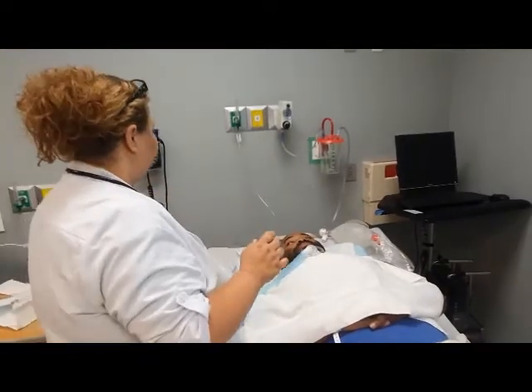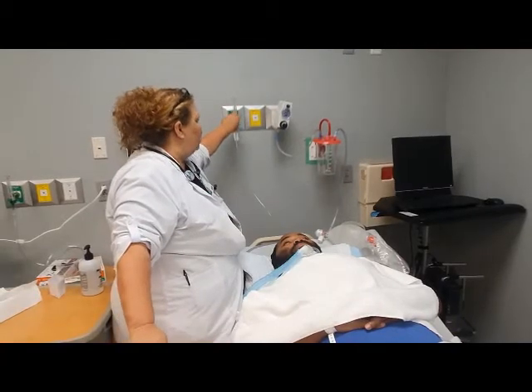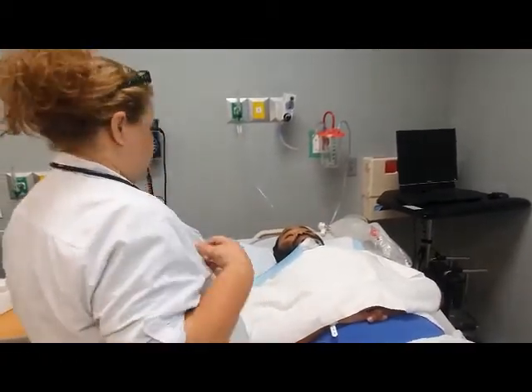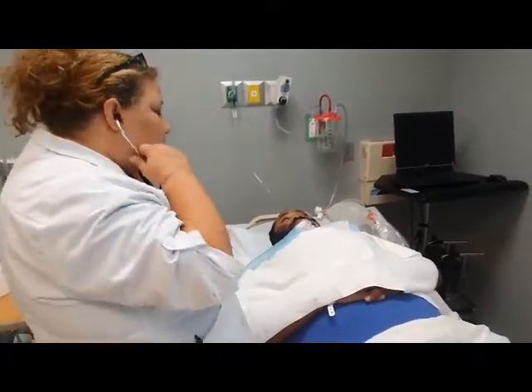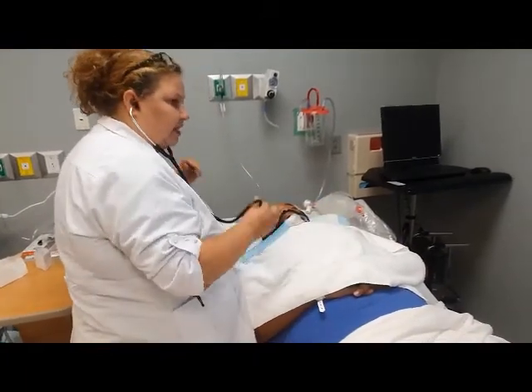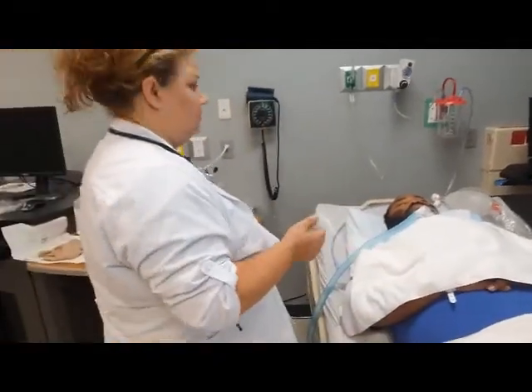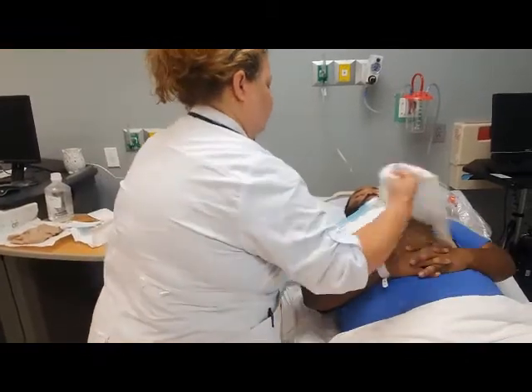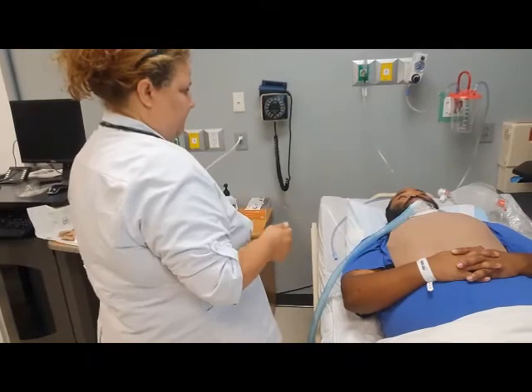Okay. All right. Suction is off. Oxygen is off to the bag mask. You reassess the client's respiratory status. Has their shortness of breath improved, their coughing, respiratory rate, etc. Then you would assess the patient, listen to their lungs to make sure that everything sounds okay. Clean your hands. And then document the color, amount, odor of sputum suctioned, breath sounds, and patient's tolerance to the procedure.